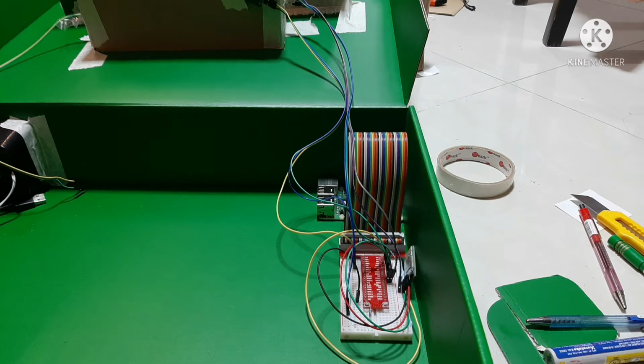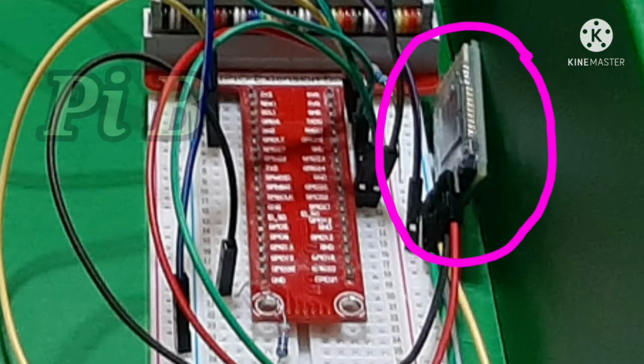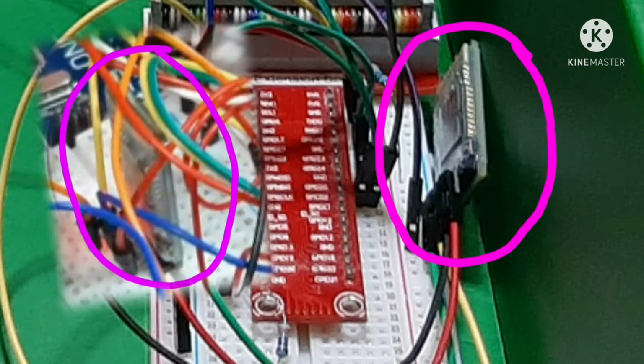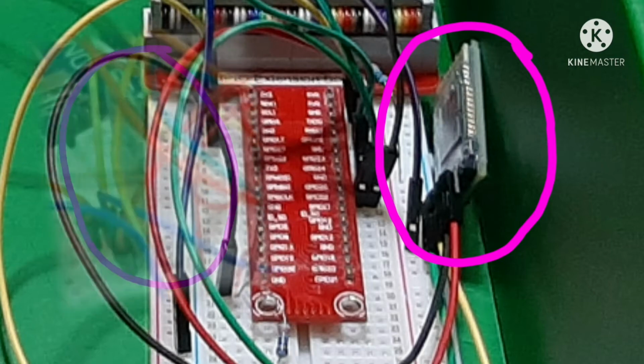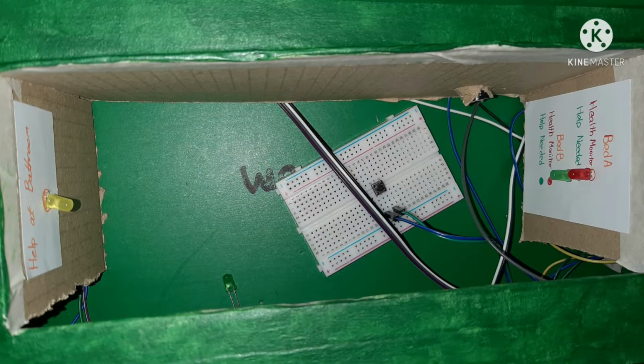Now let's look at the connection for Raspberry Pi B. There is another Bluetooth device connected to Pi which acts as a slave and is paired with the master in Arduino. Pi B basically controls the MU room, short for monitoring and utilities room.